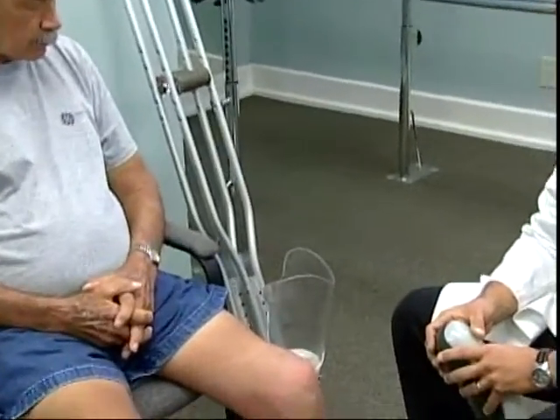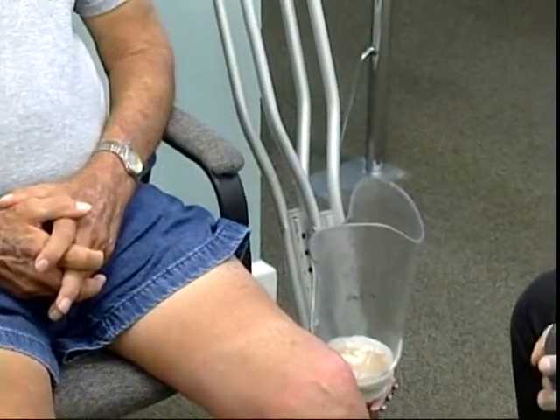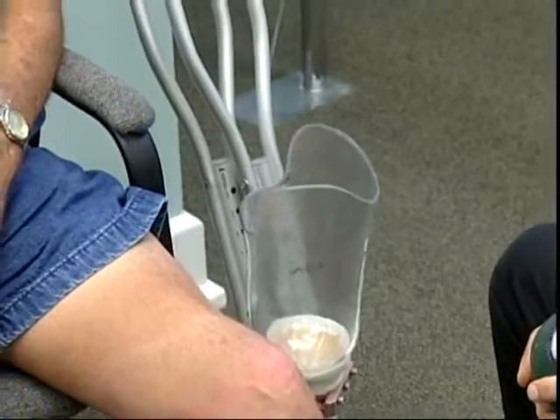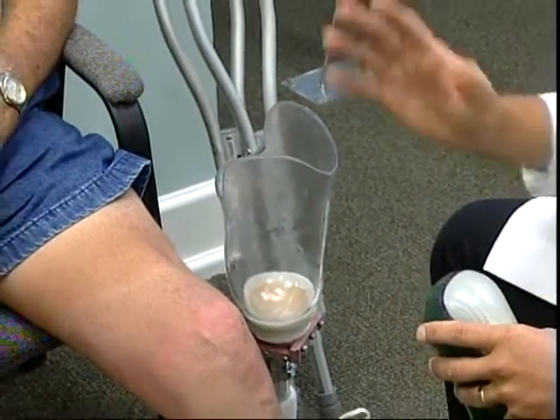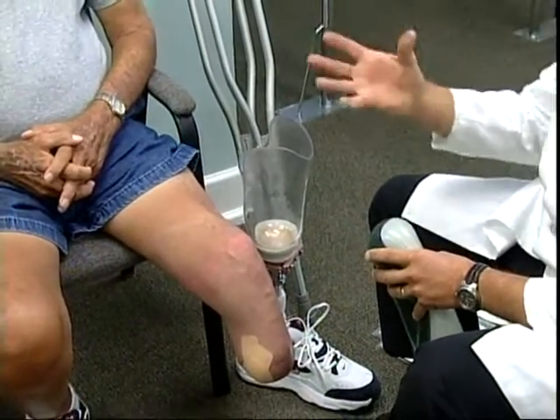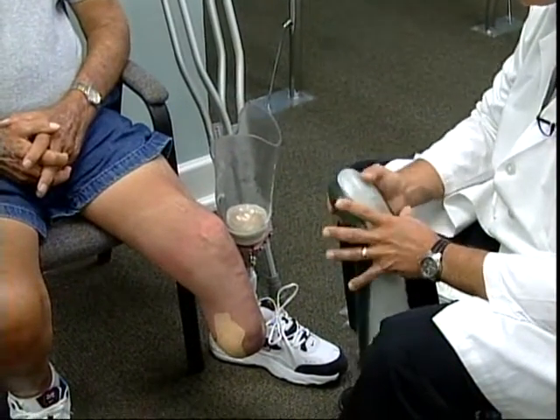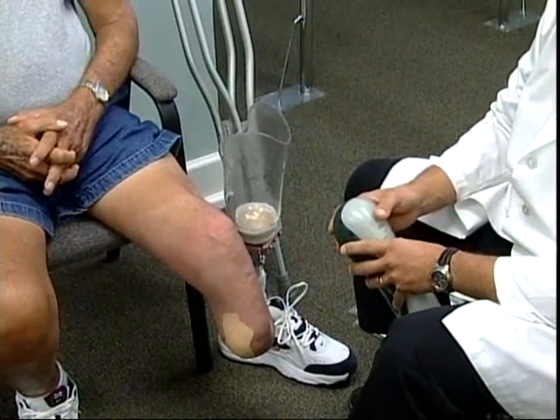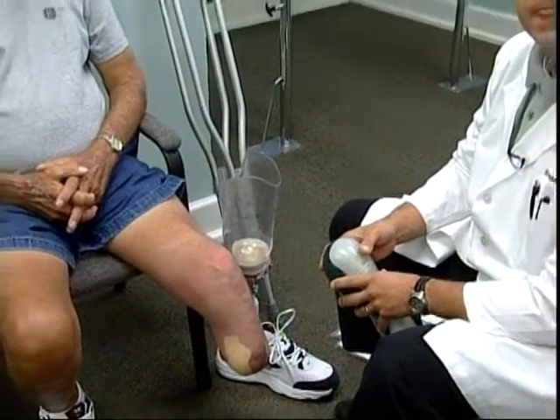And this top part of his prosthetic device, that has been custom molded to the bottom of his leg. Yes, it was. We saw Anthony a week ago, I think it was, where we took our initial impression of his limb. We put the liner in place over his limb and took measurements and took a cast impression, which was used to rectify a model and create this diagnostic socket today. Everything that we do here at Louisville Prosthetics is custom fabricated for the patients in order to help them regain their independence. Okay? Great.